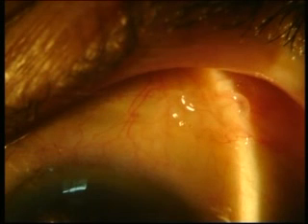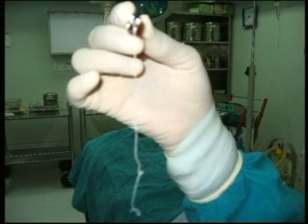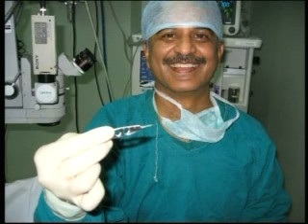This is showing you the photographs of the pre-op. On slit lamp. The eye was relatively quiet considering the size of the worm. This is the worm which is being held up. And that's the length. Most patients had negative blood test for microfilaria, and that is a happy surgeon doing good for his patients with that broad smile.